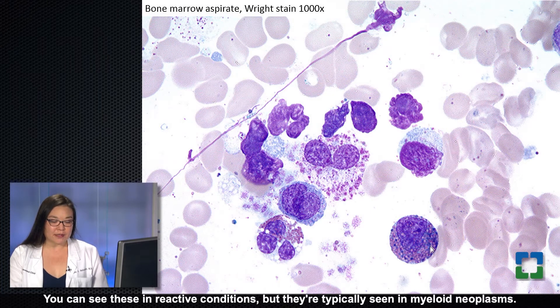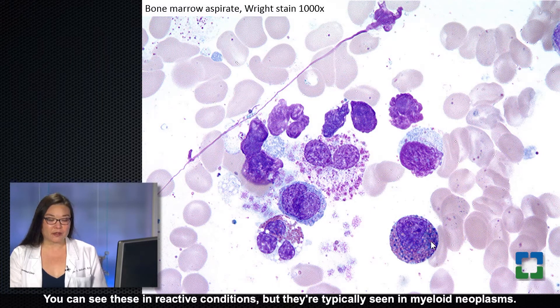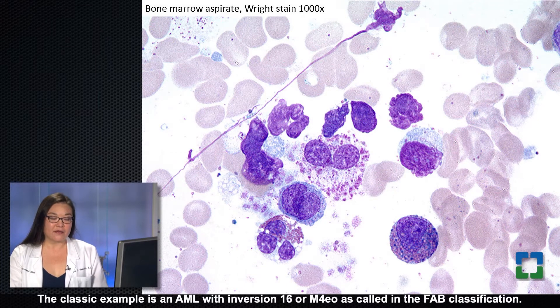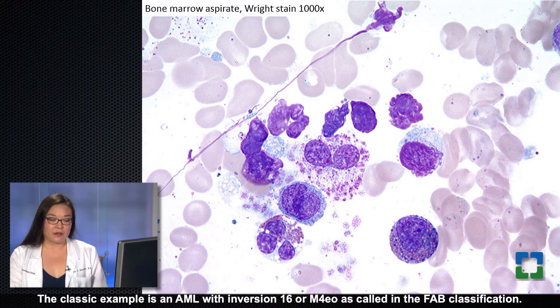You can see eosinophil precursors with basophil granules in reactive conditions, but they are typically seen in myeloid neoplasms. The classic example is AML with inversion 16, or M4EO as called in the FAB classification.